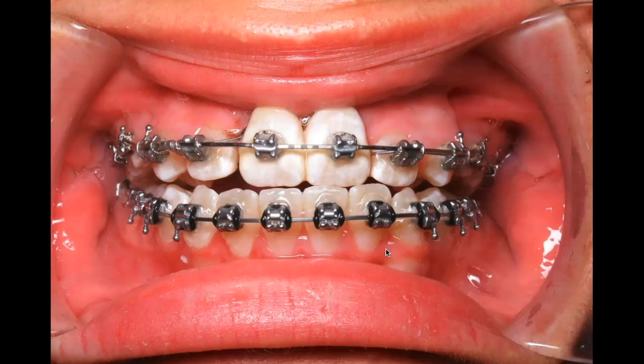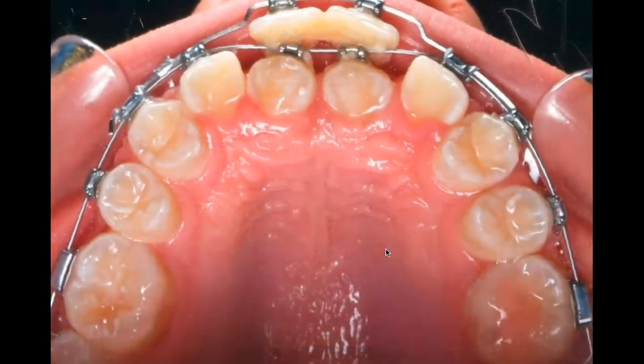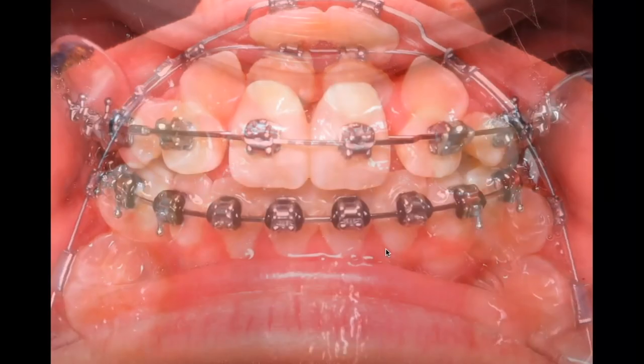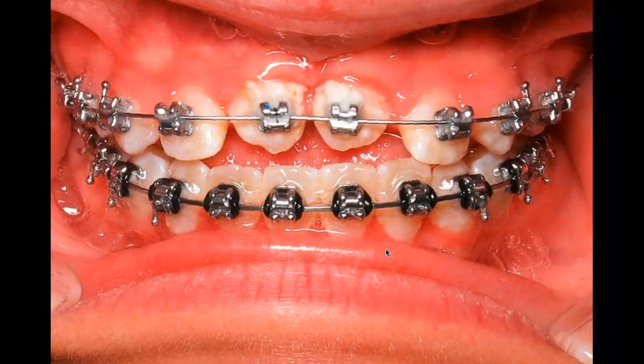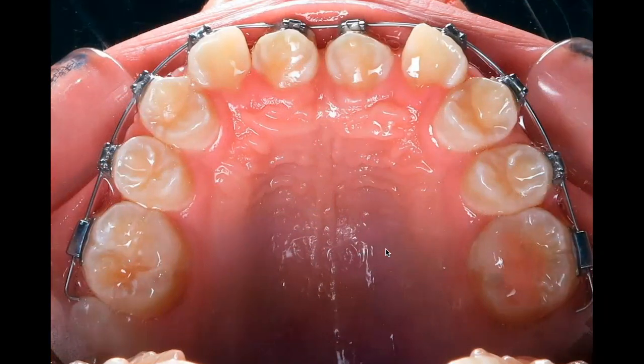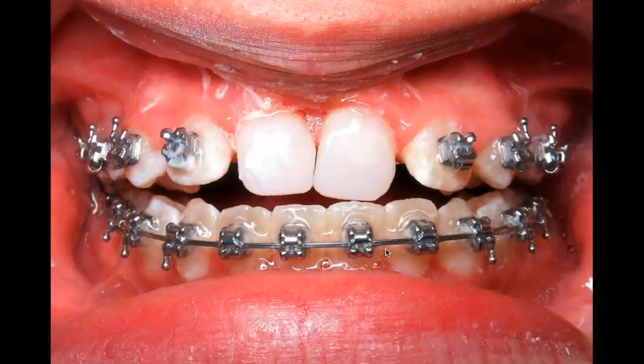And as we needed that wire to continue to work, we just sort of pushed those centrals out of the way to the point where hopefully we could get something bonded on those canines and make them look like some semblance of a central incisor before we take those out. And this is where we were at that point. And so we went ahead. You can see here we're definitely not facially where we need to be. But it was close enough that we could get something on there.